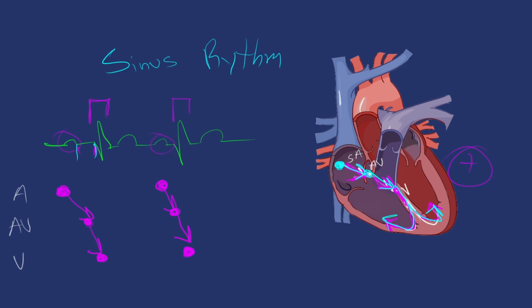Now, if we determine the rate at that point, that's how we determine if this was sinus tachycardia, right? If the rate was greater than 100 beats per minute, like we talked about. Or if the rate is 70 beats per minute, then we have a normal sinus rhythm. If the rate was less than that 60, or that intrinsic rate for the SA node, we had a sinus bradycardia. So that's how we can hopefully start to understand how the EKG is tossing this signal down through.